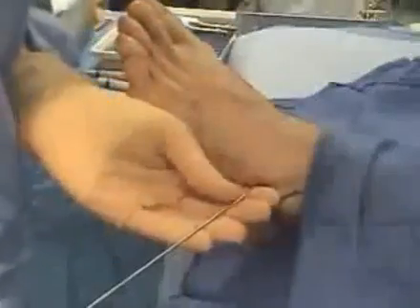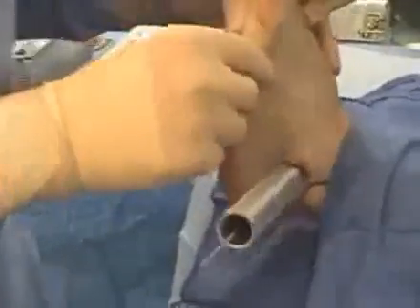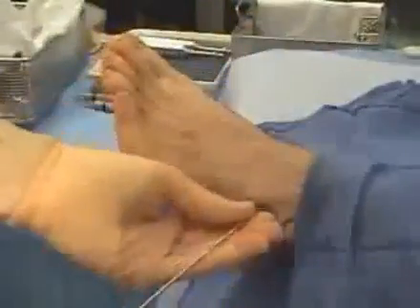So again, you can just see without the stent in there, we're getting a lot of valgus deformity and excessive pronation. So we're going to keep inserting the different trial sizers until we find the one that gives us the right amount of pronation, which is about 3 degrees. Now you can see with that size 7, we're getting very little pronation and mainly just dorsiflexion. Now again, this is under fluoroscopy.